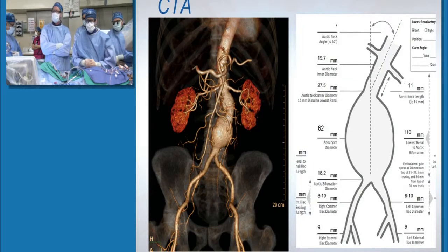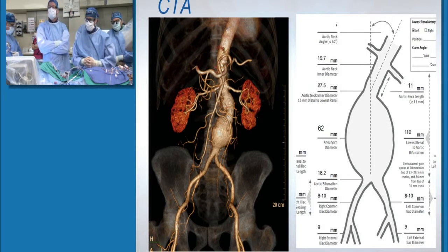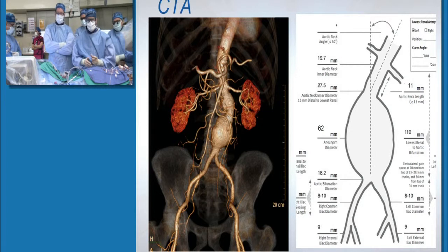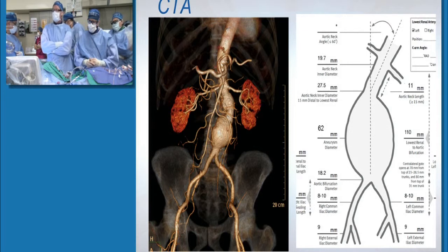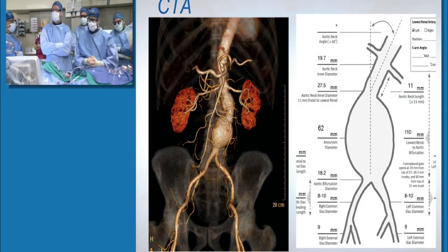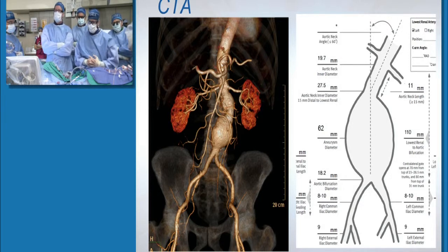Here's a 3D reformat image from his CTA. You can see he has an infrarenal abdominal aortic aneurysm which has a bilobed configuration. The more superior component is about 3 centimeters. The more inferior component is 6.2 centimeters. It extends just proximal to the bifurcation, sparing the common iliac arteries. The preplanning sheet is listed there.